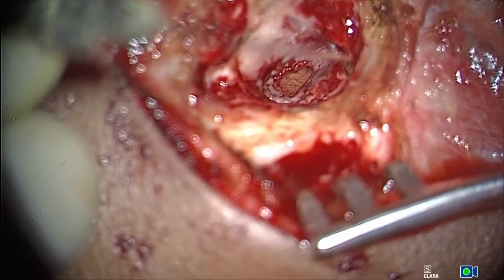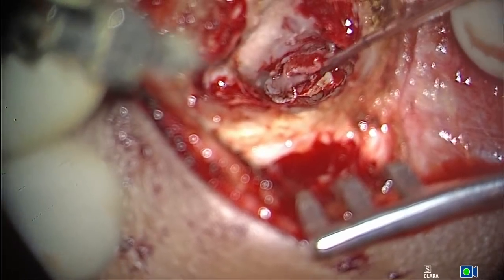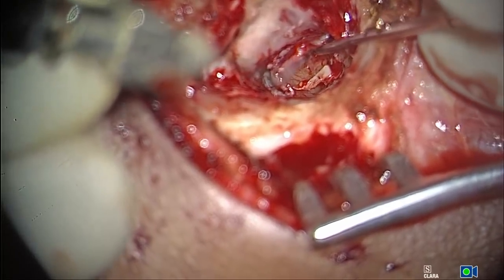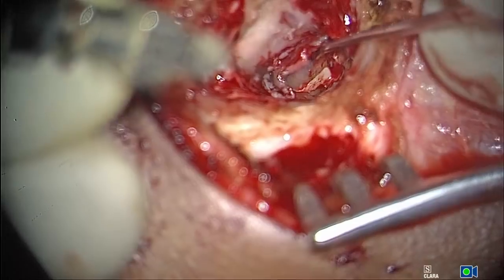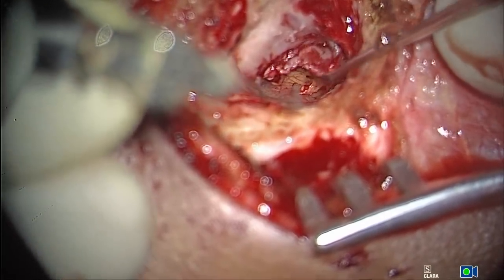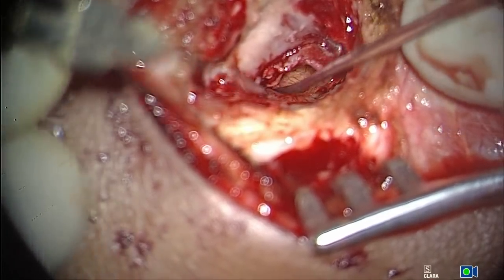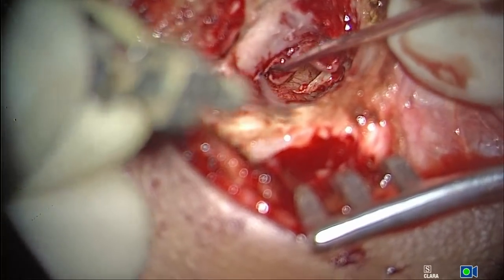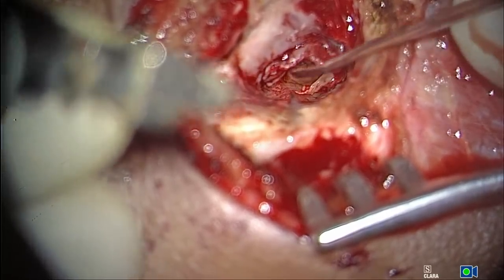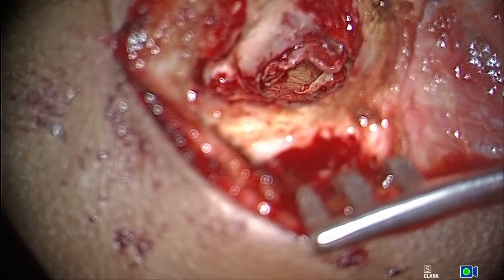So again, I'm telling you again and again, I always look at the status of the middle ear mucosa. And if the status of the middle ear mucosa looks healthy and good, then believe me, I will have a good success rate in my grafting. So this is my criteria for now. The malleus incus is a mobile joint, so that is my criteria for this. Give me the graft.